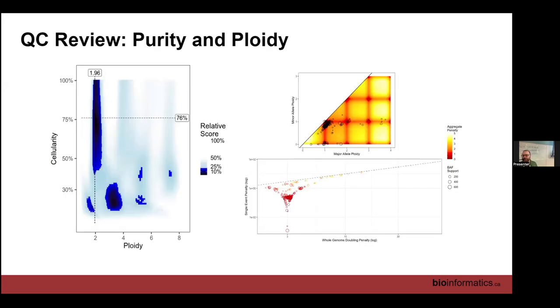The output from Purple looks something like this. On the left-hand side you have a heatmap plot of purity-ploidy solutions — high probability regions colored dark blue, low probability regions lighter blue, and very low probability is white. On the right-hand side there's more detail. The upper part, with a grid of orange squares, has black spots representing segments of the genome. Each segment has an estimated purity and ploidy, and Purple averages those to get figures for the entire genome. The bright red regions of that plot are regions of high probability, and we can see that most of the black dots are in red regions — that's good.